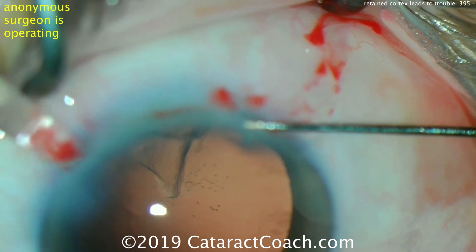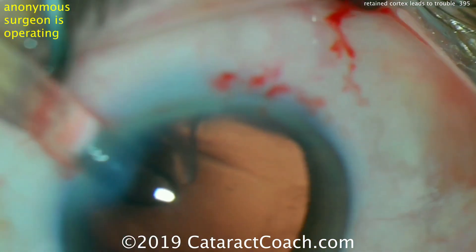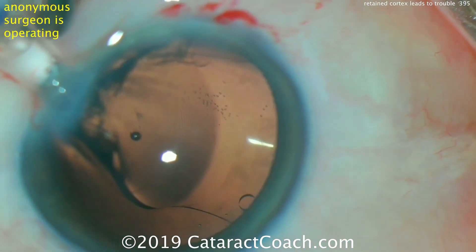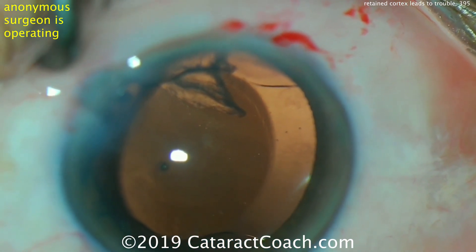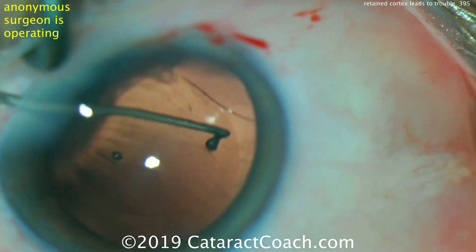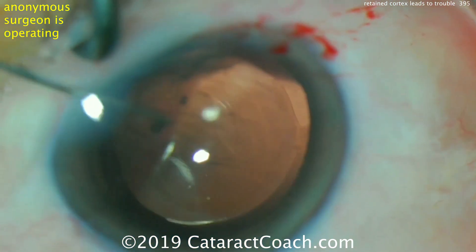There's one little triangle of cortex that remains. The eye is now filled with viscoelastic and the surgeon is delivering the IOL into the eye. This looks like a single-piece acrylic lens with some multifocal rings — a lens not currently available in the U.S. One good move here is to rotate the lens and have the haptics stir up and release some of the adhesions of the remaining cortex.